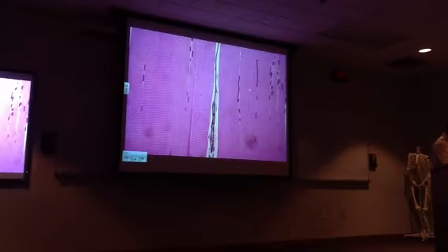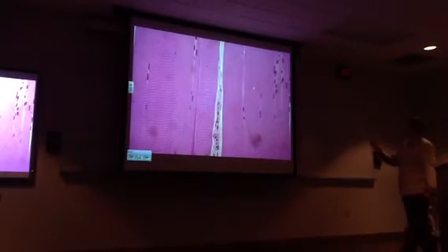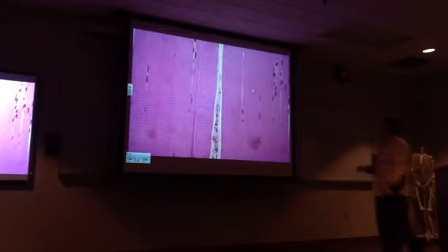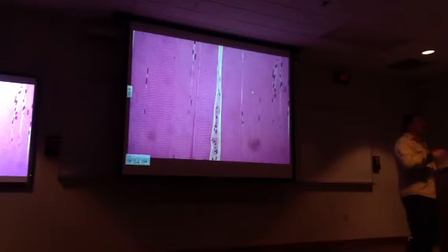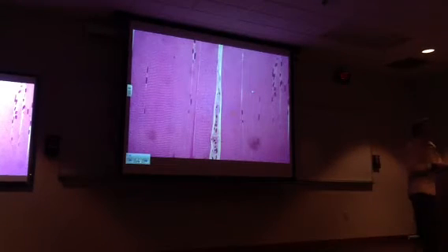Okay, these nuclei, let's make it simple, let's make a diagram of it. Okay, these nuclei are either nuclei of fibroblasts making the endomysium, or they're nuclei of the skeletal muscle cells, or they're stem cells, satellite cells in the skeletal muscle. And it's really kind of difficult to know at a histological level what's what.